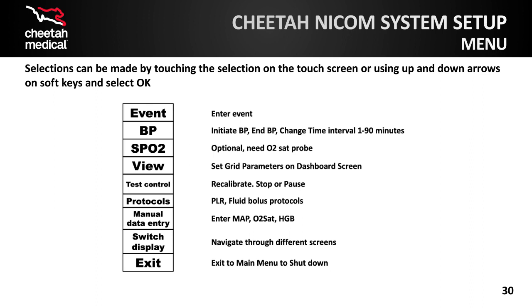Protocols for passive leg raise or fluid bolus protocols. Manual data entry to enter MAP, oxygen saturation, or hemoglobin. When the latter two are entered, DO2I will be displayed. Switch display in order to display different screens. Exit to turn the monitor off.